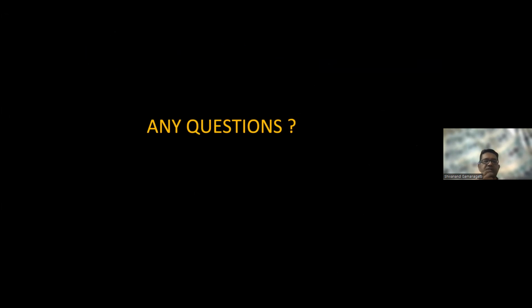Dr. Shalimar, this is the first part. If you have any questions regarding this part, you can ask. Okay, I think we had an excellent presentation from your side, highlighting the basic utility of investigative modalities which every gastroenterologist or hepatologist needs to know, right from ultrasound, CT, MR. And we've got a couple of questions in the chat box. Dr. Kesri Singh wants to know what is the criteria for saying hepatomegaly or splenomegaly on an ultrasound?